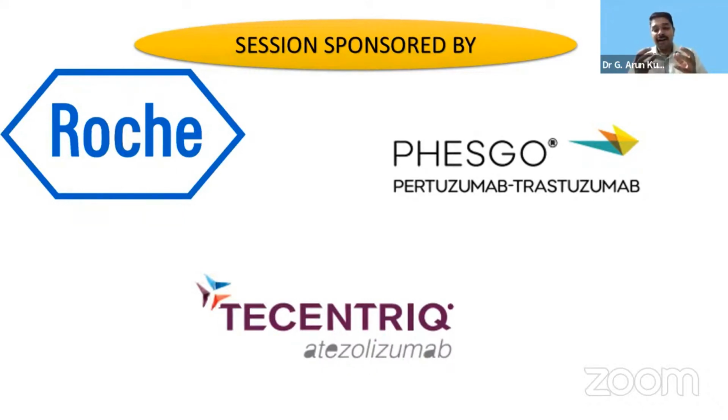So number one, you have to look for the accreditation. Accreditation alone does not suffice, but proficiency testing. And then in the report, try to see the depth of sequencing, which they have done. Ideally for somatic, it should be 500x. Anything less than that might reduce the quality. There is a very good possibility of getting a false negative.